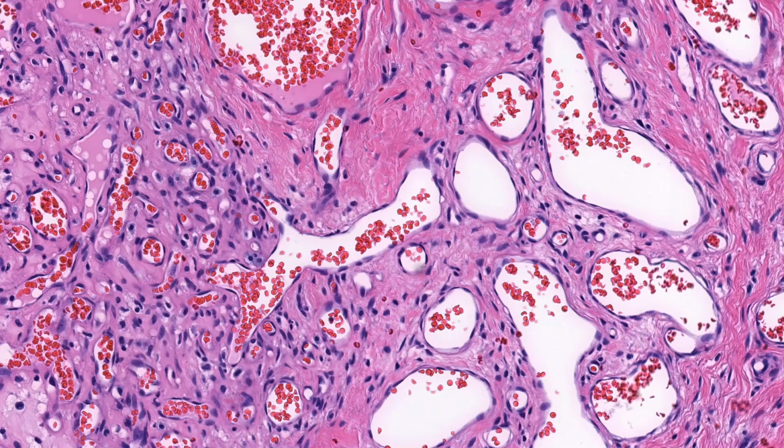Sometimes these are called pyogenic granulomas, which I'm not a fan of because it is neither of those things. In contrast, lobular capillary hemangioma is a perfect name. It's comprised of capillaries, arranged in lobules, around large feeder vessels, and it's benign.